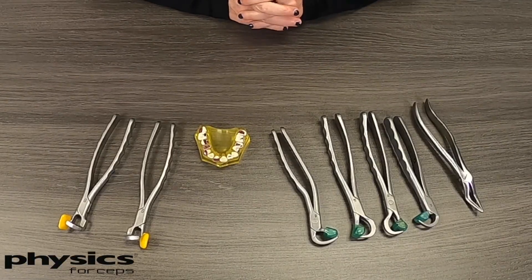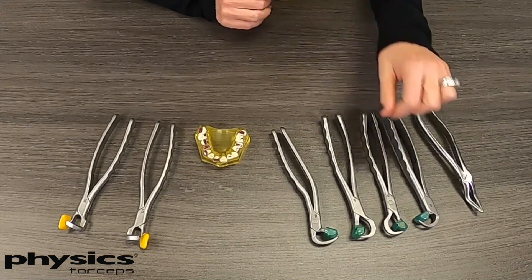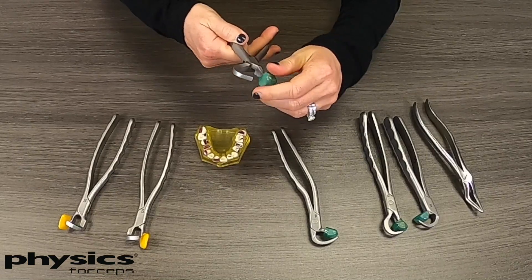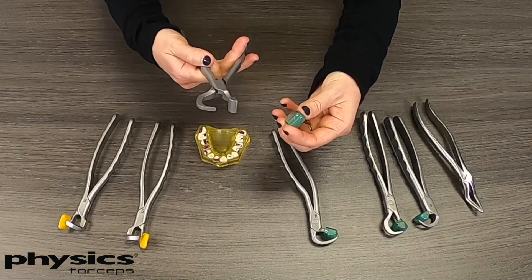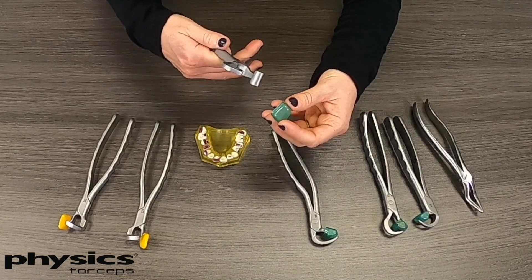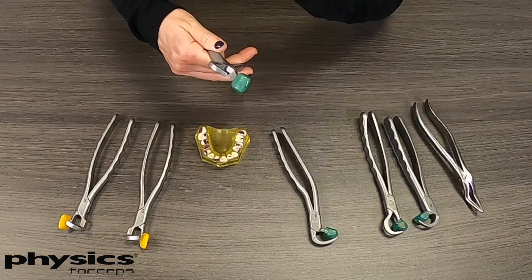When we're at trade shows demonstrating the Physics Forceps, we get a lot of commonly asked questions. One of the first is in regards to these bumpers. The bumpers are disposable — we usually recommend one per patient. They come off very easily and are single use with blister pack packaging, so before you do an extraction you can just pop one out of the blister pack, place it on the instrument, and then you're ready to go.